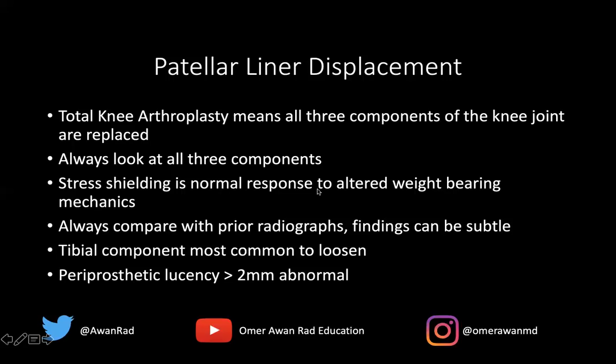You always want to look for any periprosthetic lucency measuring more than 2 millimeters. If you have more than 2 millimeters of periprosthetic lucency, your differential should include three things: aseptic loosening, infection, or particle disease — a macrophage or histiocyte-induced response to the arthroplasty material such as metal or polyethylene, which results in osteolysis and radiolucency around the bone. Those are the three things to consider: aseptic loosening, infection, and particle disease.